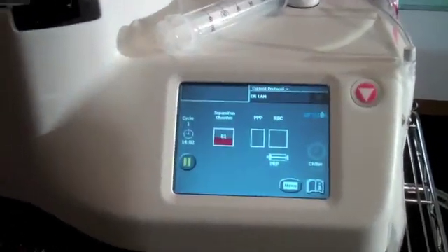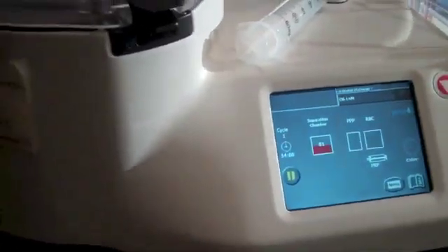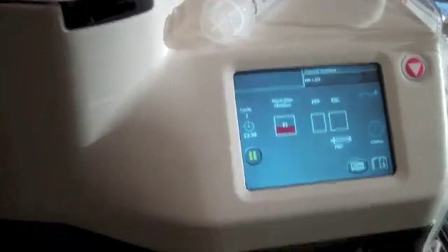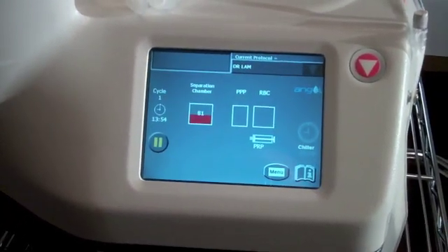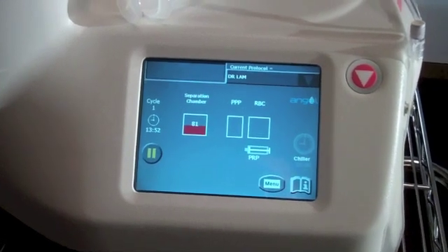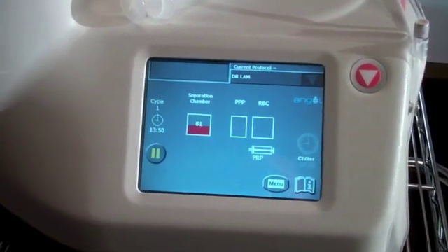We're going to harvest from here using the robot. What you're seeing here is state-of-the-art technology. This is platelet-rich plasma — the Angel system — which is a type of regenerative medicine that will really help the growth.